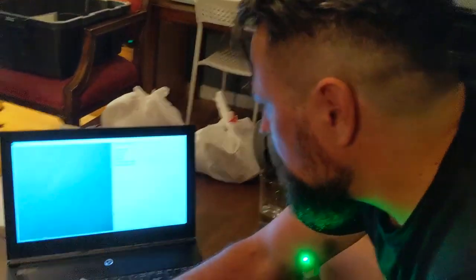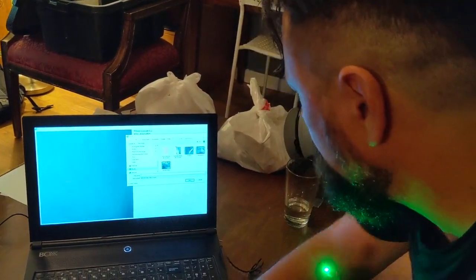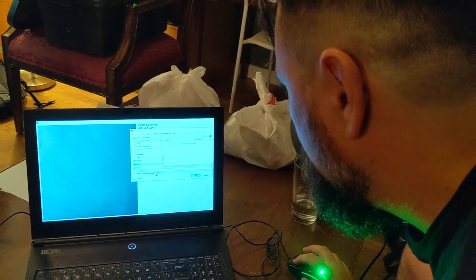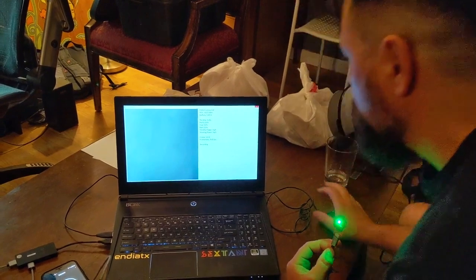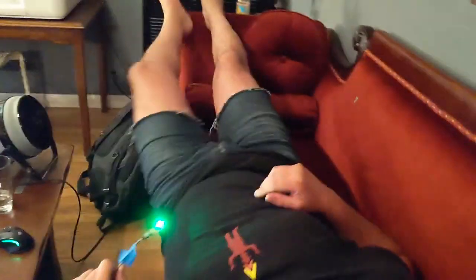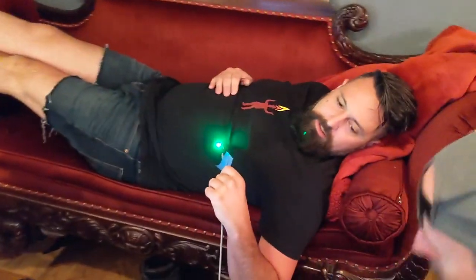Let's start a little video here. PillBot Connected — Inside Tori. You want to save it? Let's get the file name of 1 and save. So now it's going to be recording here. PillBot Inside Tori. Why don't you lay down flat and get comfortable. We're seeing some features in there. Here we go.